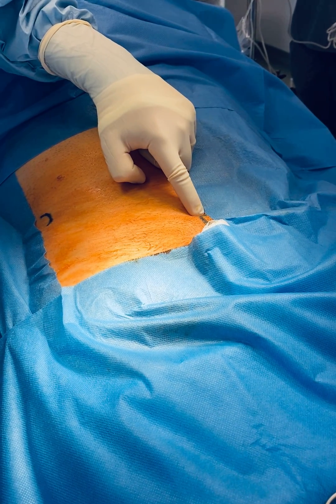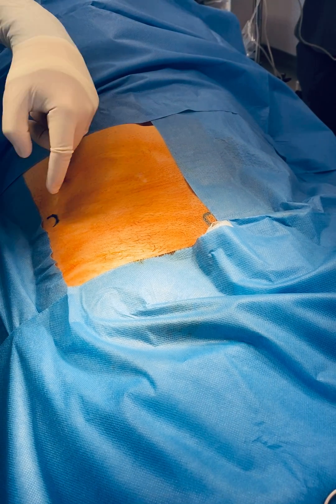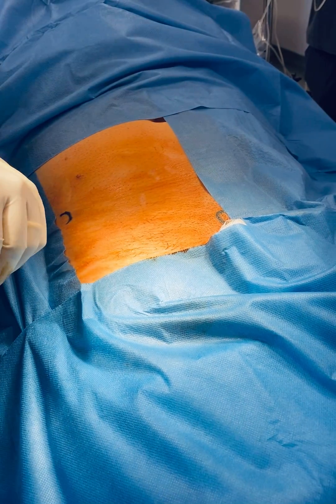The pubic tubercle is marked here and the anterior superior iliac spine is marked here. The inguinal ligament runs along the line between those two, and our incision is going to be just above the inguinal ligament.